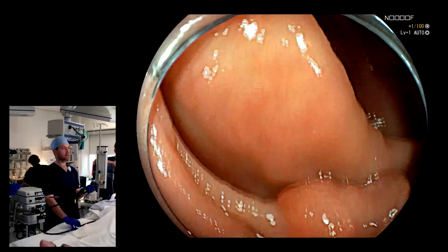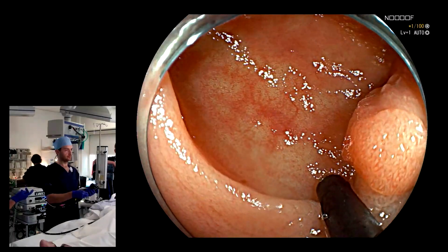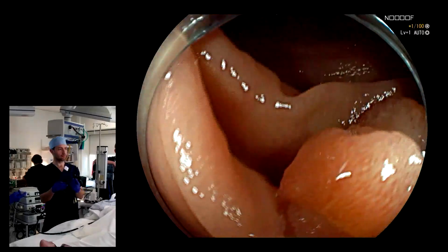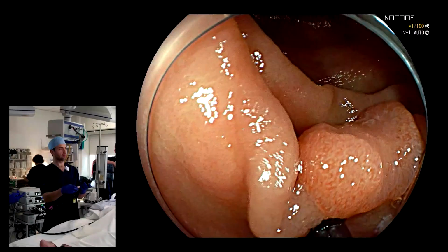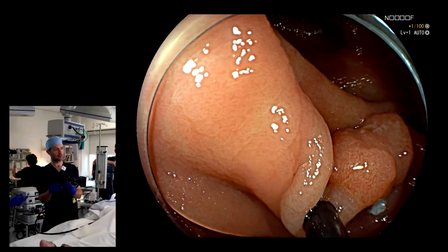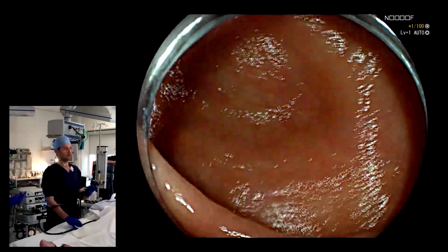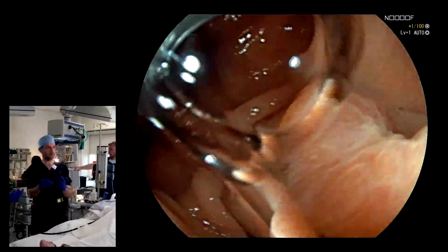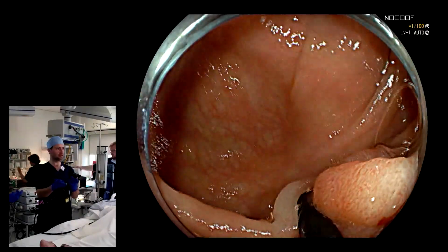Marking off the lesion there at the back. Left side. It's kind of presented itself a bit better to me here, so maybe I can do this. And this. Okay, and then finally this back edge will not be easy to mark here because of everything to do with this polyp really. So I'm going to have to slightly blindly mark it down here.